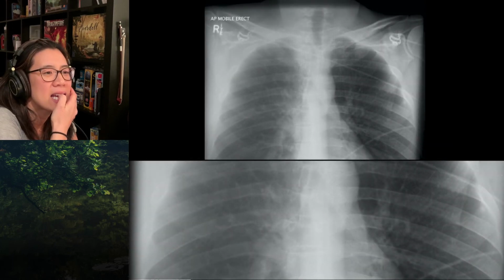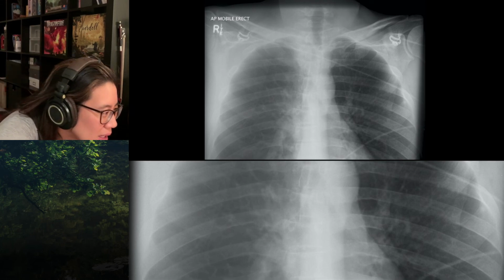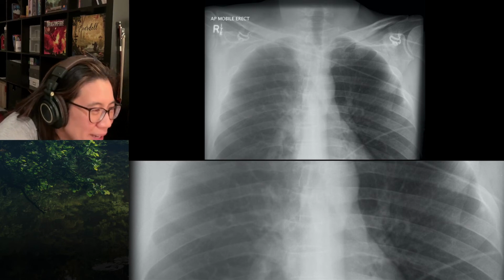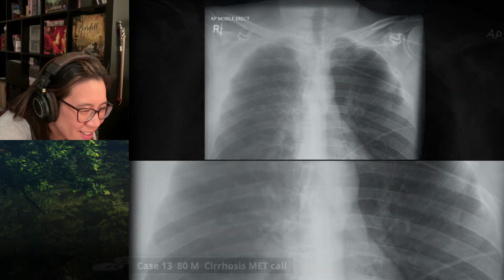Yeah. And so you've got grid lines on the next image. I've magnified them up. My eyes aren't good enough, but you can see you've got grid lines on the left side and no grid lines on the right side. Yes. And the right's under it. So this is a grid cut off. Wow. Nice. That's lovely.